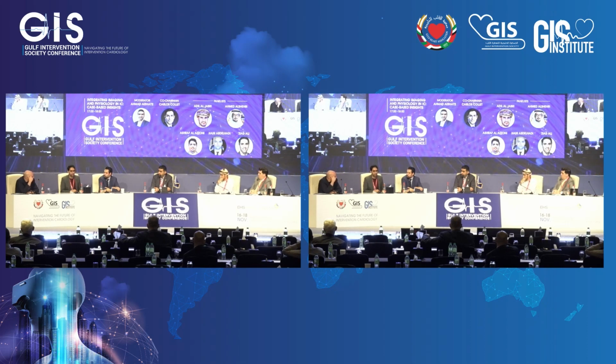Well, the first strategy we suggest, of course, is to do more balloon dilation. Part of the reason the nodule reprotrudes is because in the areas of nodule, there's 4 times the amount of calcium. So what you're doing is you're basically scaffolding the nodule with 2 rocks on either side. So A, high pressure balloon dilation.